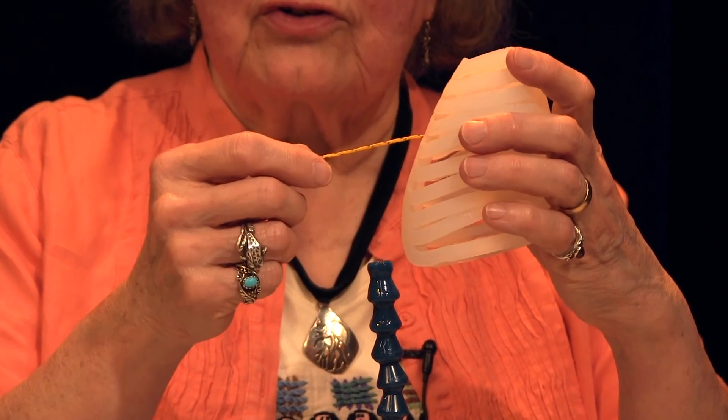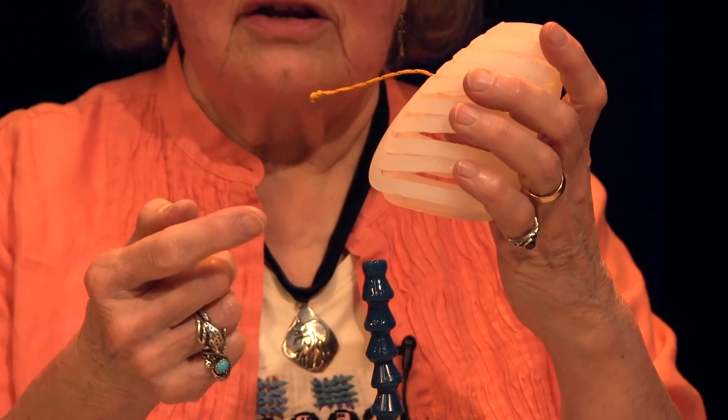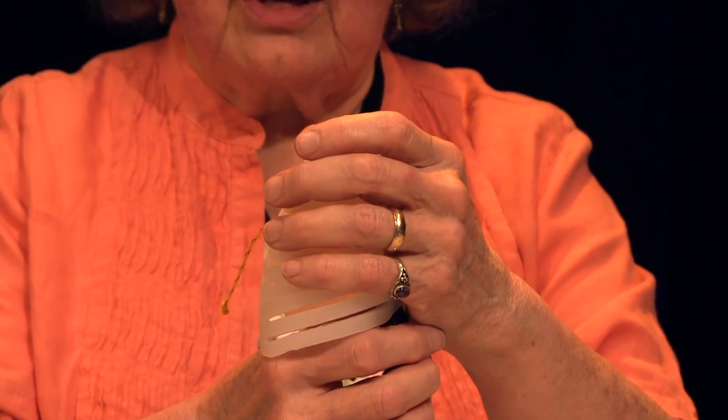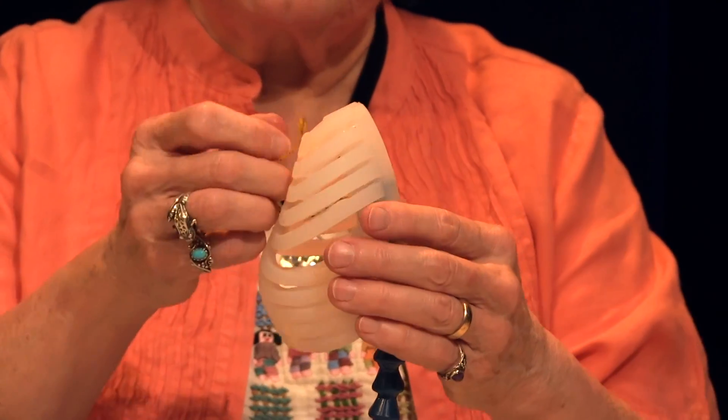Pulling it taut ensures that the cord knot inside the spinal column tunnel doesn't become dislodged as you put on the chest. Gently slide HAMI's chest down over the spine beads until only the top two beads are showing.